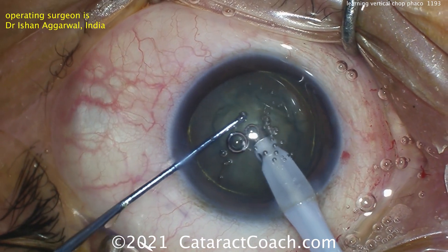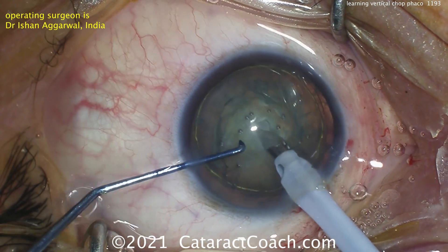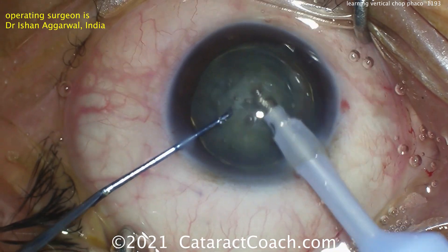Burying that probe, holding the nucleus — try again, get the bubbles out. Bury the probe, deepen the nucleus, and now the chopper can be pushed downward, and you can separate the halves.